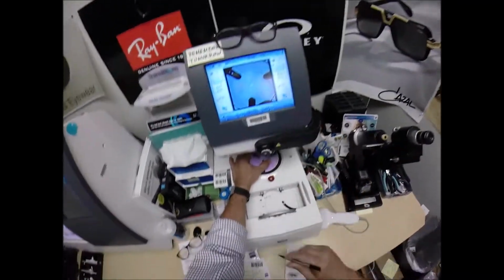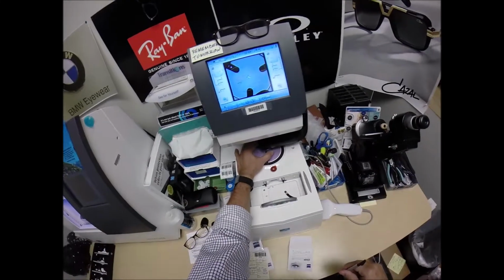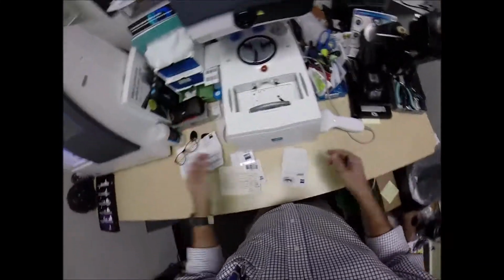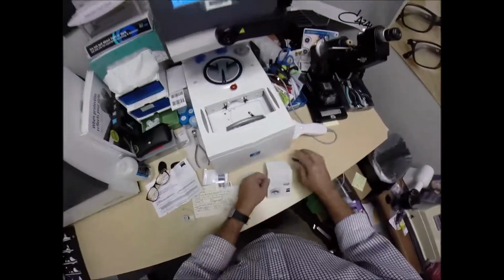All right, so I'm gonna hit that button. The arm comes down, places the block onto the first lens. We're gonna do the same thing now for the left lens.